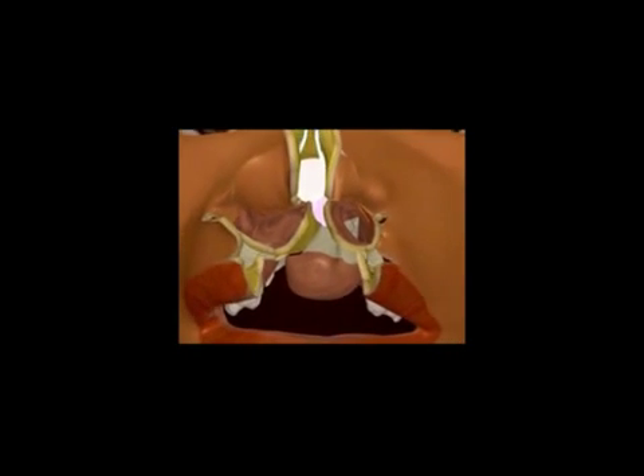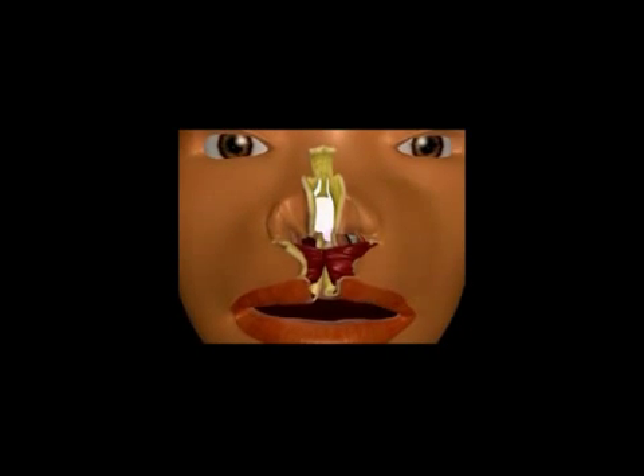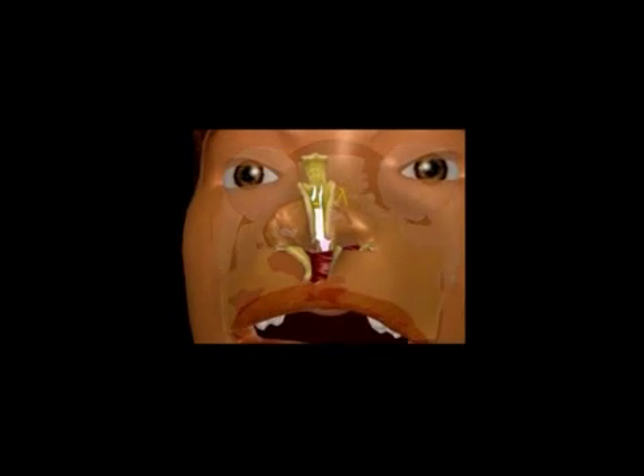The inner aspect of the lip is closed, and most importantly, the muscle is repaired in the lip. Now you see a suture being placed. This absorbable stitch will bring the cartilages of the nose together into a normal orientation at the end of the procedure. As that stitch is tied down, the nose is put back onto its normal connection to the septum, and the centerpiece of the prolabium is used to make the lip.